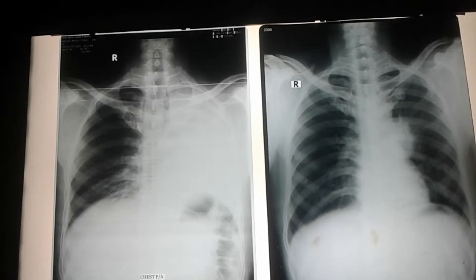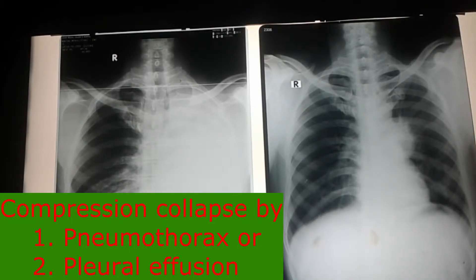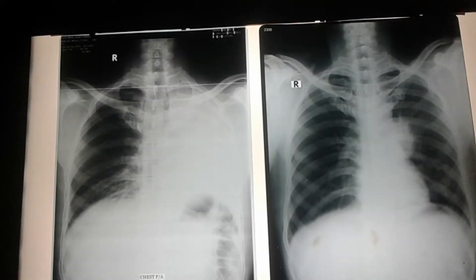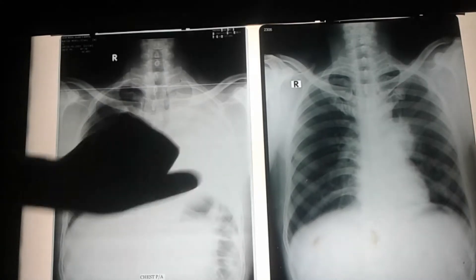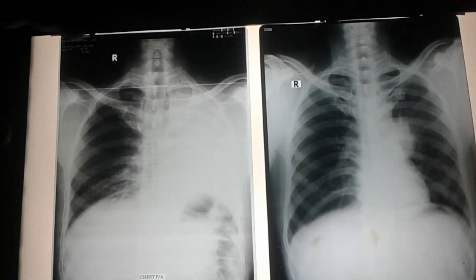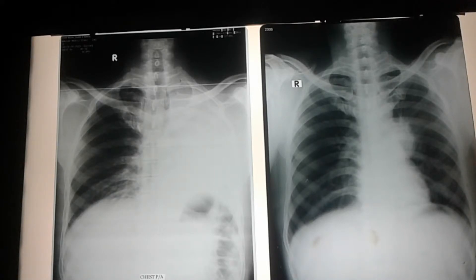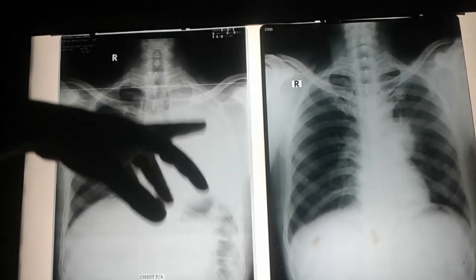This is called absorption collapse. The other type of collapse is compression collapse, which is caused by either pneumothorax or pleural effusion. As this lesion was present previously, and 10 days later we found this picture, we can summarize that this lesion might have caused compression of the bronchus leading to absorption collapse.